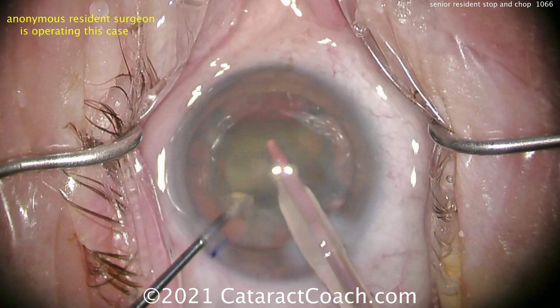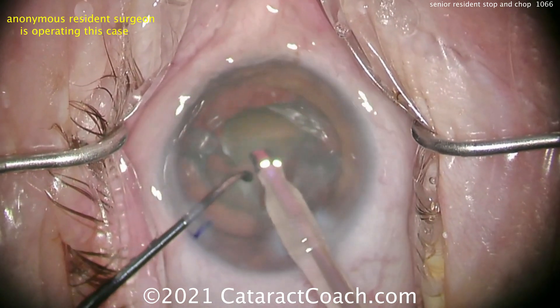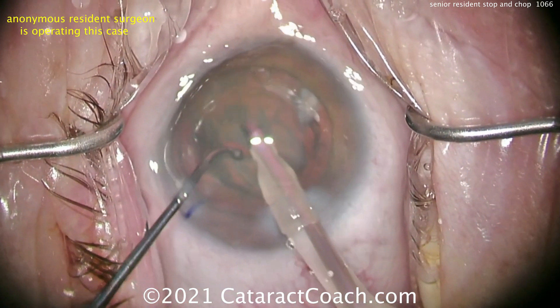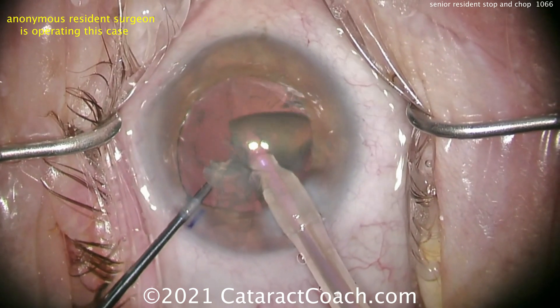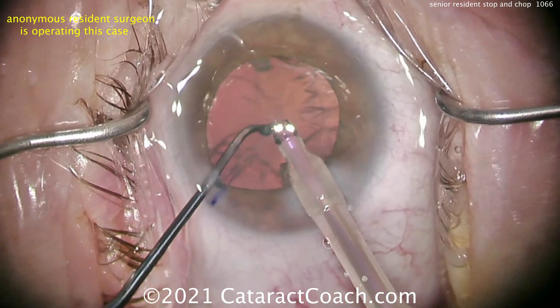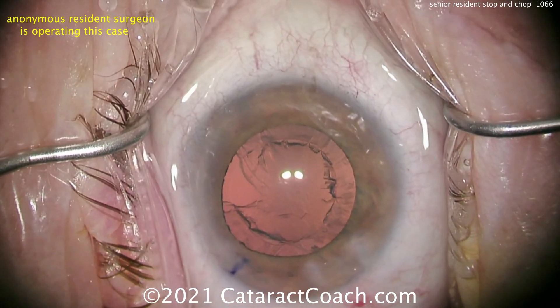Now taking on the pieces one by one — really nice ability to move within the eye, bring the pieces around. Left-hand dexterity is good here. Remember: if you're just starting to learn cataract surgery, you better improve that non-dominant hand dexterity. Don't use your dominant hand for anything until you get that dexterity up. Nice, clean removal of the nuclear fragments. Chopper in the safe position. As much as I dislike those ball-tipped choppers, this went beautifully. It's a fantastic case so far — that's a very lucky patient.